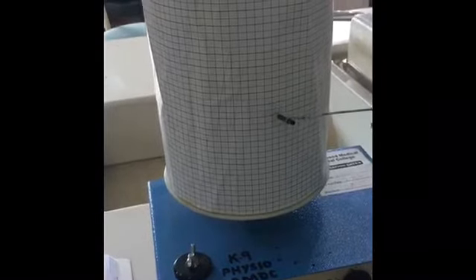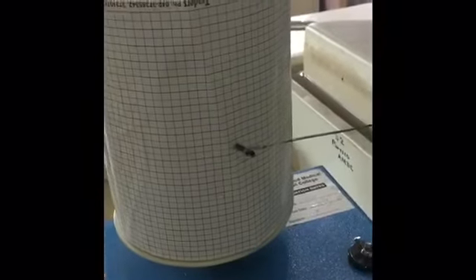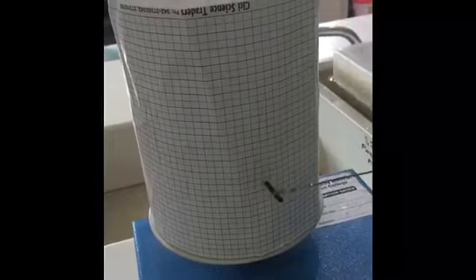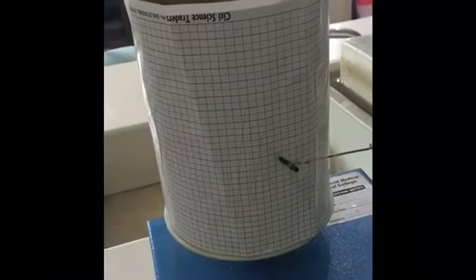This is the expiratory reserve volume. Now the subject takes two to three normal tidal volume breaths, and then you give the subject the vital capacity maneuver — taking the deepest possible breath in and then forcefully exhaling all the air out. Then the subject takes a normal breath again. Finally, you turn off the spirometer and thank the subject.